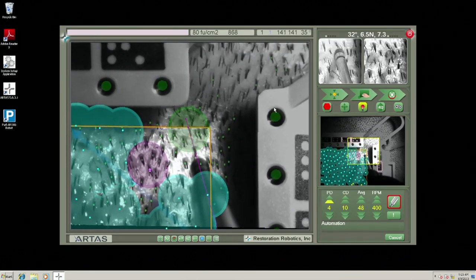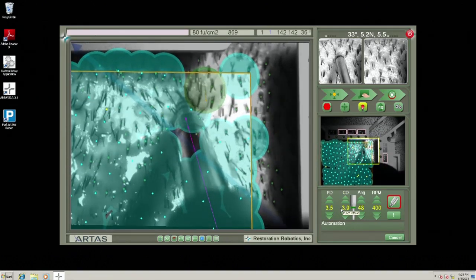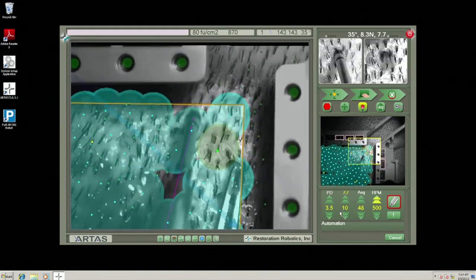Now, at the conclusion of the dissections here, you should be able to see that these grafts are sitting in their holes, but they're just ever so slightly out of the hole. And I'll talk to you a little bit about this in just a second.